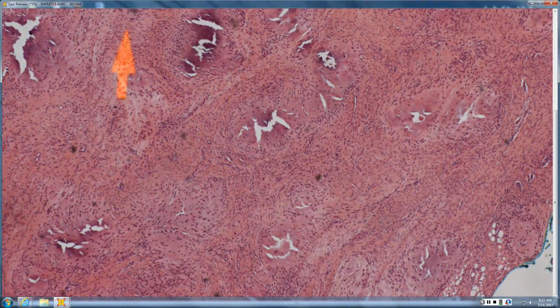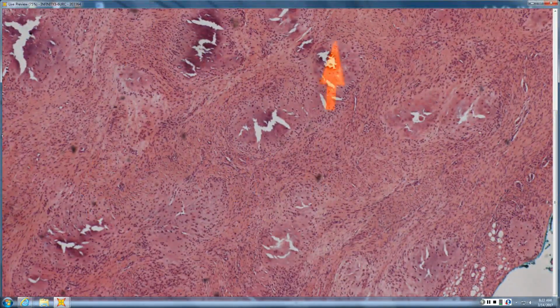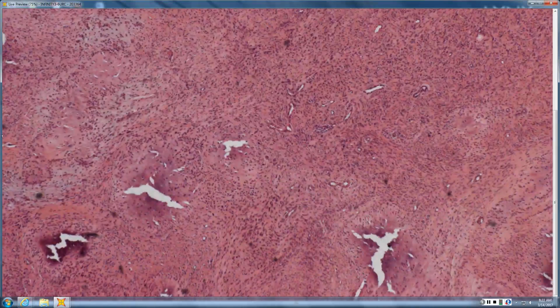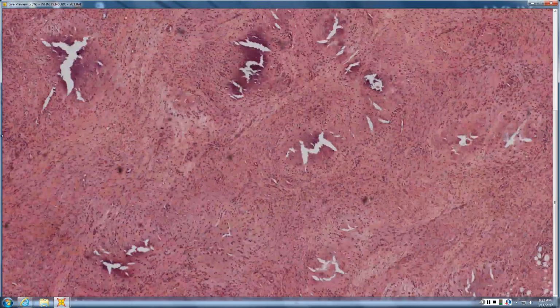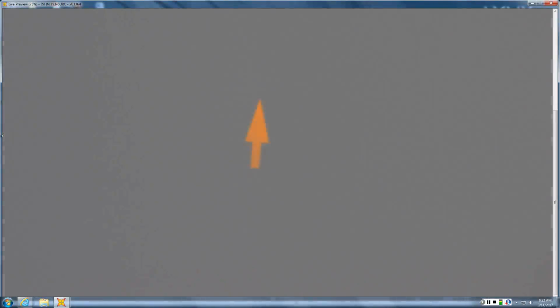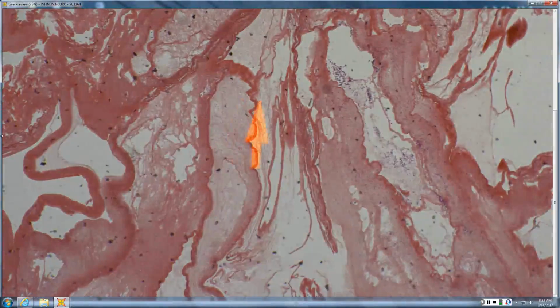It's calcifying, it's aponeurotic, it's a fibroma, and it very characteristically has these palisades with calcification in the center. Often a little cartilaginous type change, sometimes even bony type change in there. But a broad fibroma of the aponeurosis, palisades, central calcifications. So the calcifying aponeurotic fibroma. A lot of them have, fortunately, very descriptive names.